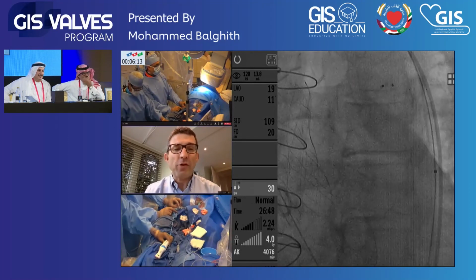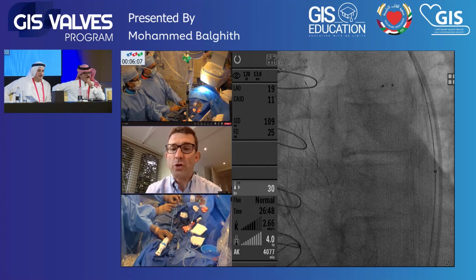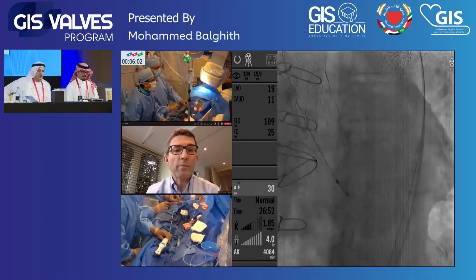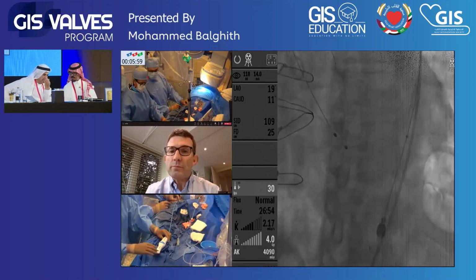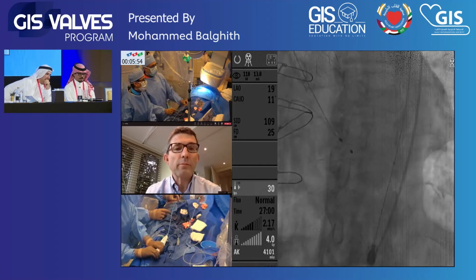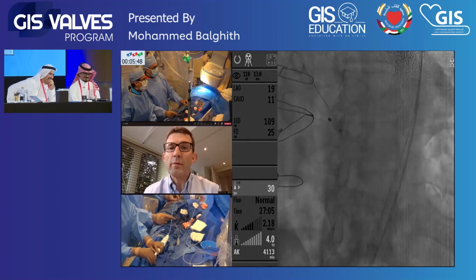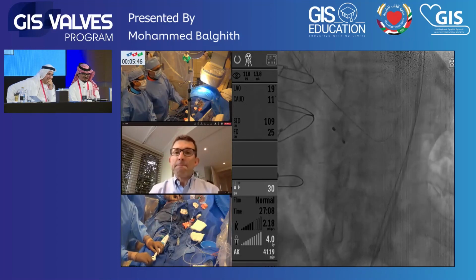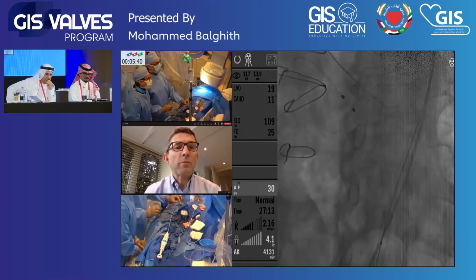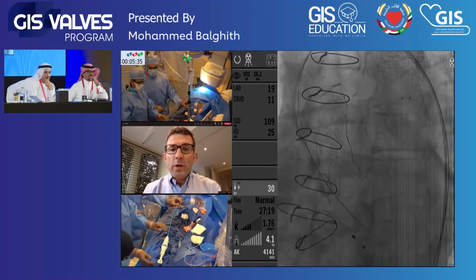And then in the descending aorta, relocate the nose cone into the delivery catheter for ultimate retrieval in due course. Okay. Your left hand stable, and right finger to your button and take right. Done. I did them all, two hands. Yeah. Good. I think that's good. Now I need a wire to take the pigtail. We'll keep our wire.